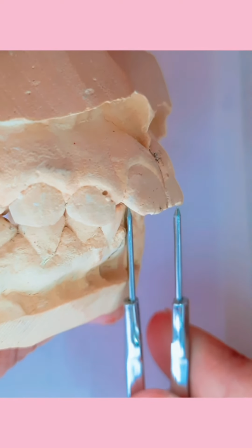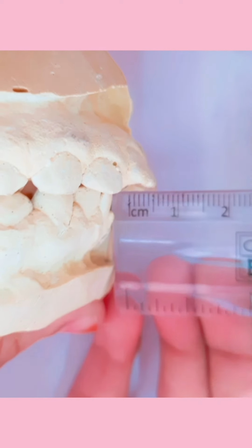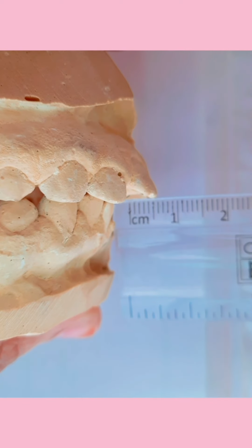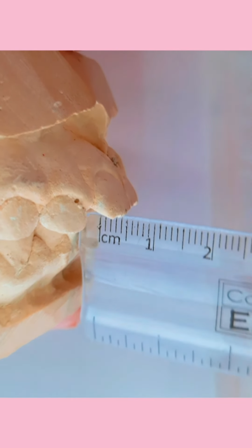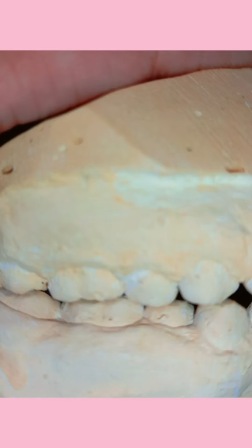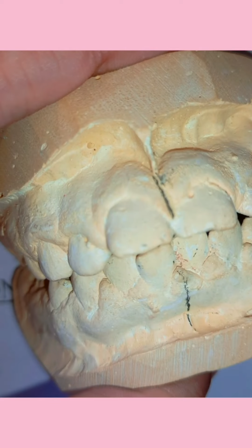Now we measure the overjet with the help of divider from the incisal edge of lower incisors till the upper incisors. Okay. Some measure it with scale, but I suggest you use a divider. That will be more accurate. Keeping the divider at the incisor edges of upper and lower anteriors, we measure that. Also check the occlusal relationship of the molar, it is class 1. That is mesiobuccal cusp fitting into the mesiobuccal groove of the lower molar. Mesiobuccal cusp of first molar.